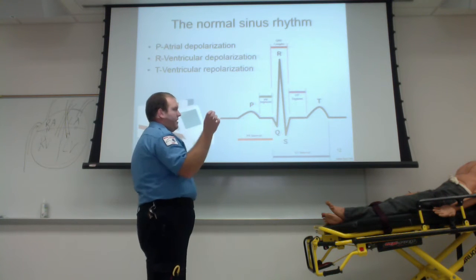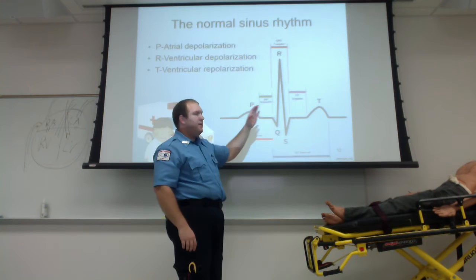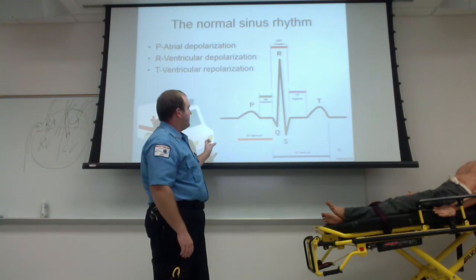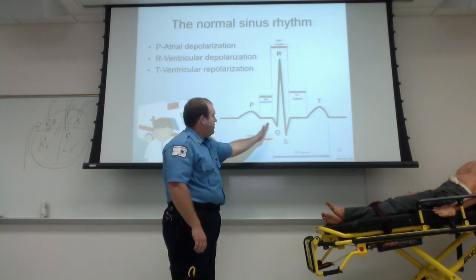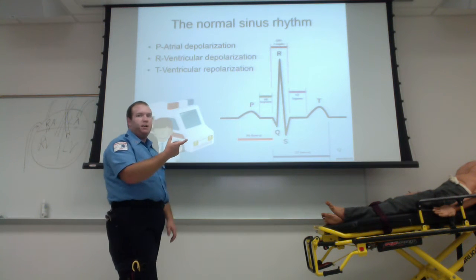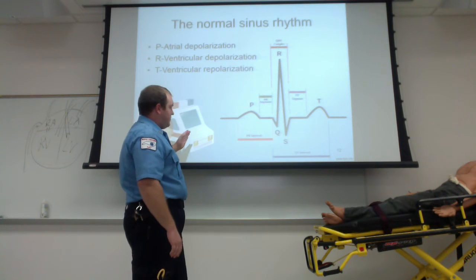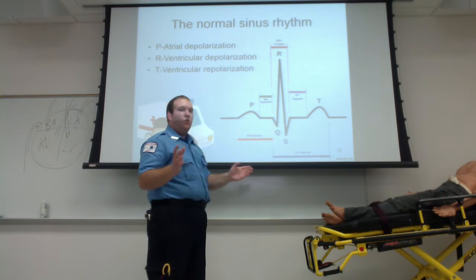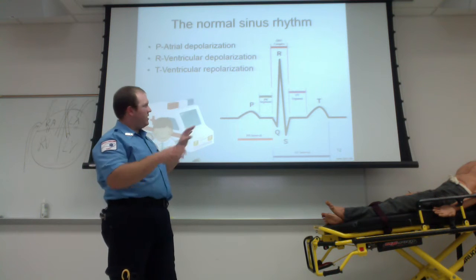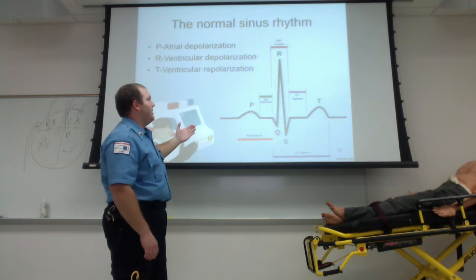And again, once you overlay this with your 12 lead, you can see how much time each portion takes. For example, your normal PR interval should be less than 0.2 seconds, which is one of the darker pink lines, or red lines depending on your machine. And in length, don't worry about knowing that. We'll pull the two items together in a minute, so that you can understand better what we're talking about.